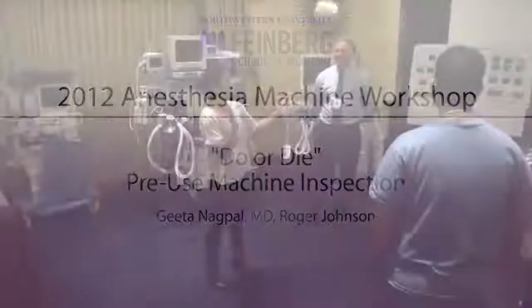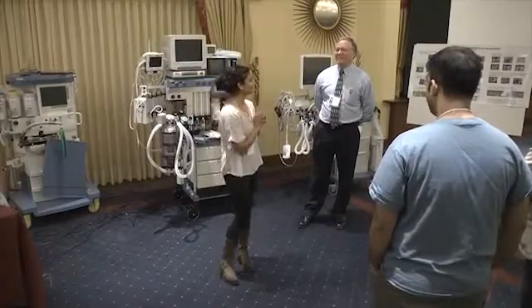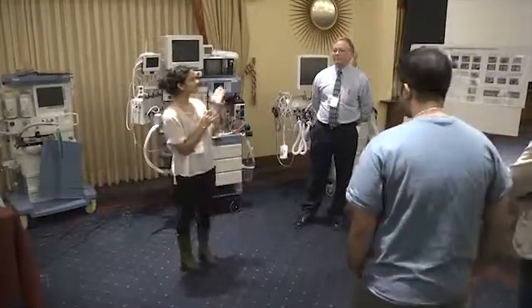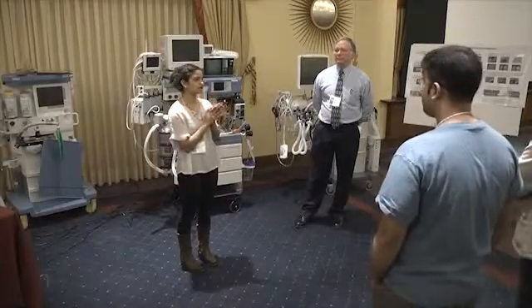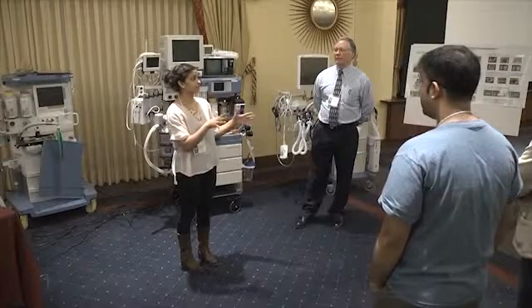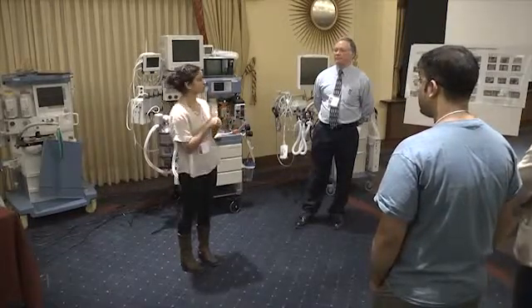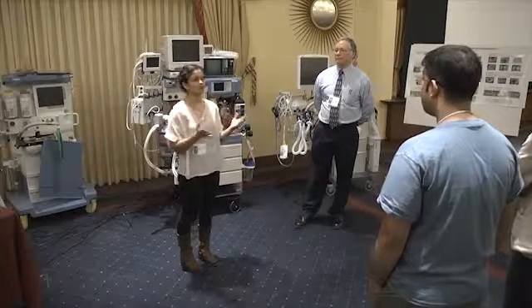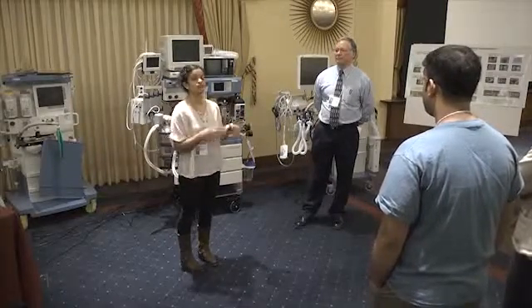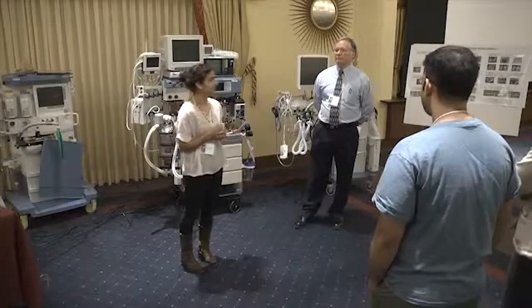Very dramatic, the do or die station. So it's to put emphasis on the importance of the pre-anesthesia check, the checkout that you do prior to any case, so your first case of the morning. I guess we didn't really go into subsequent cases because you don't have to do everything over again, because a lot of the stuff you're just making sure is in the room and working appropriately and you're not necessarily using it.